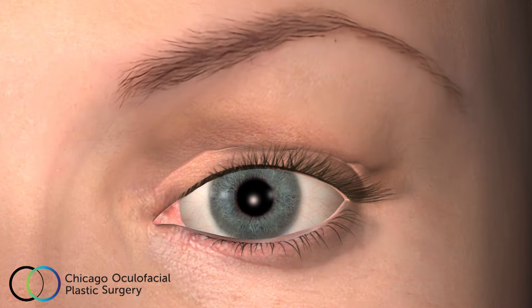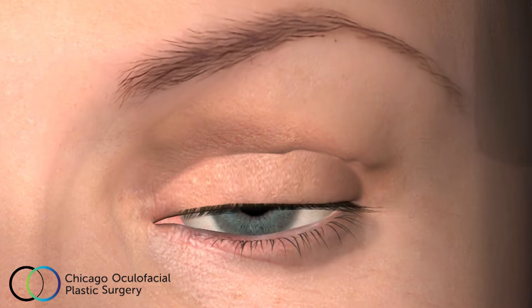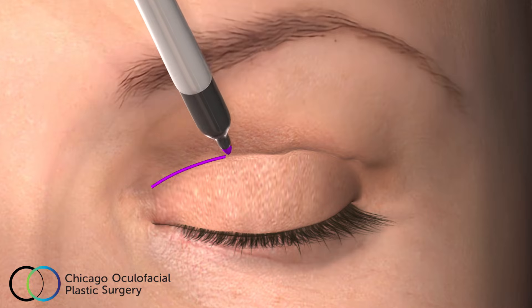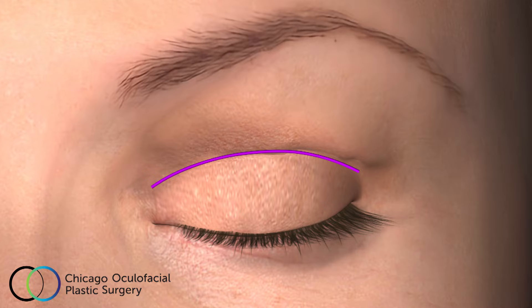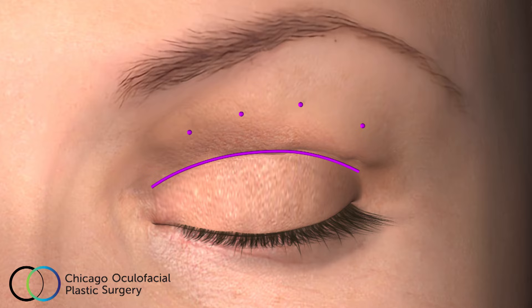The first step of upper blepharoplasty surgery will be to anesthetize your eye with numbing eye drops. The surgical area is then sterilized with alcohol preparation swabs. The natural eyelid crease is then marked with a sterile marking pen, taking into consideration your specific anatomy and objectives of upper eyelid surgery. Your surgeon will then carefully check that enough skin remains outside the boundary of the marking so that you can easily close your eyes after you heal from the operation.